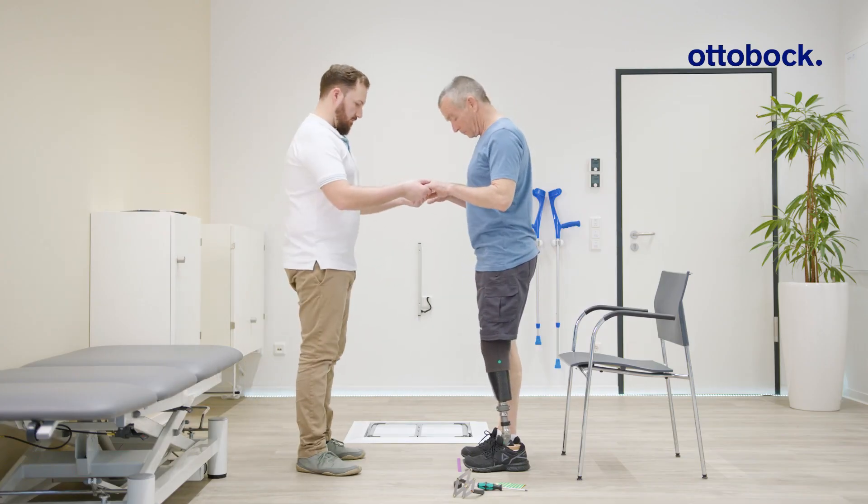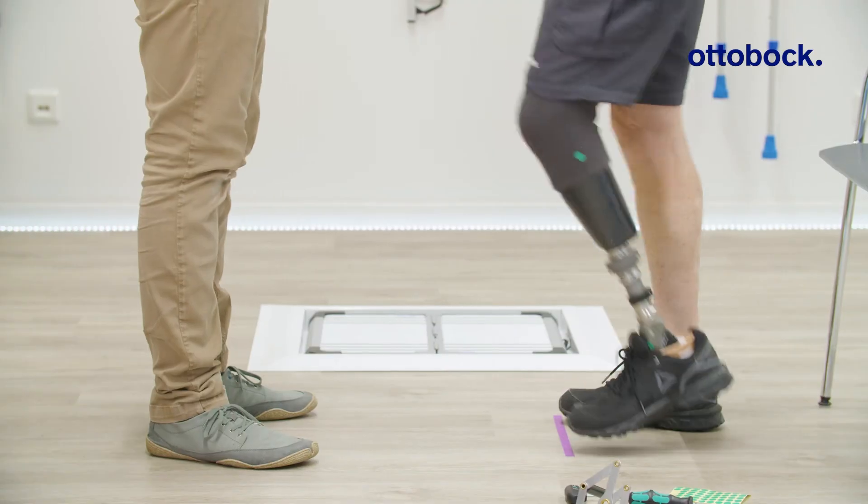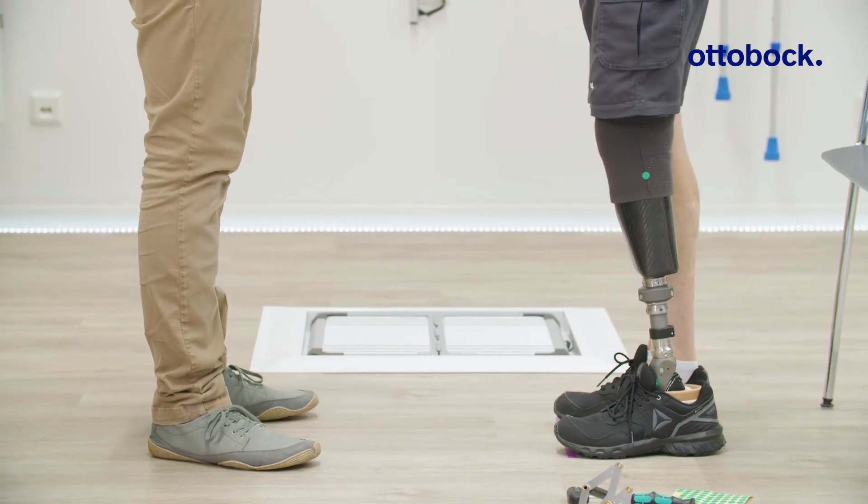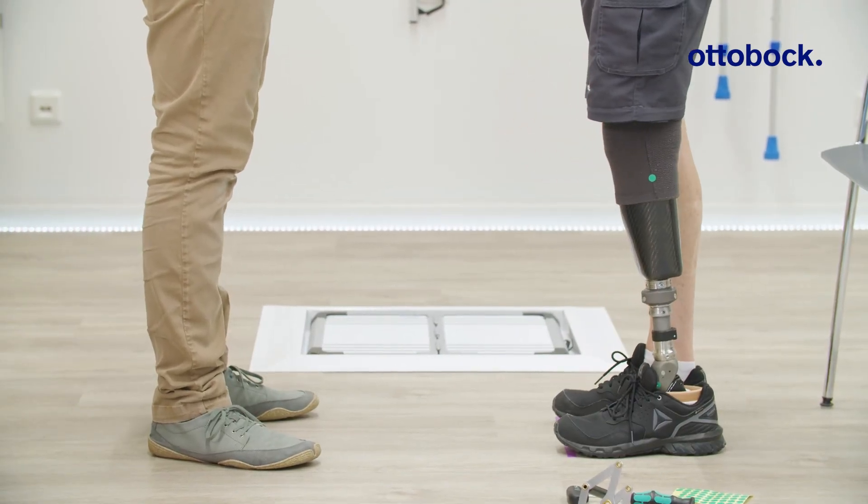Repeating the step test confirms the corrective effect of all the static alignment changes that have been made.